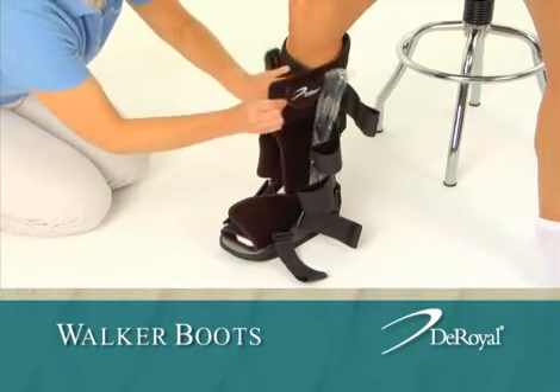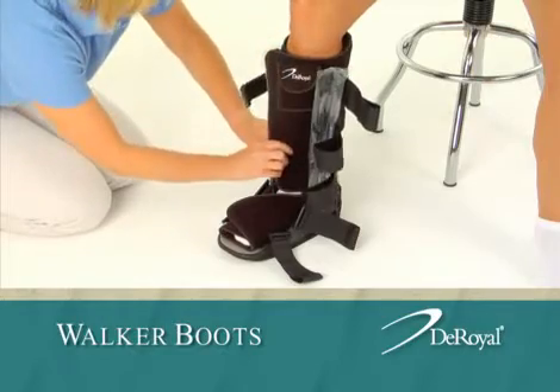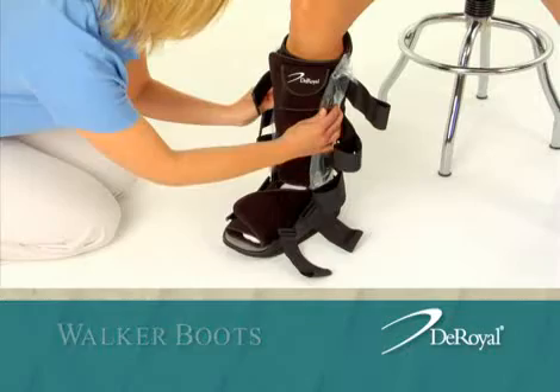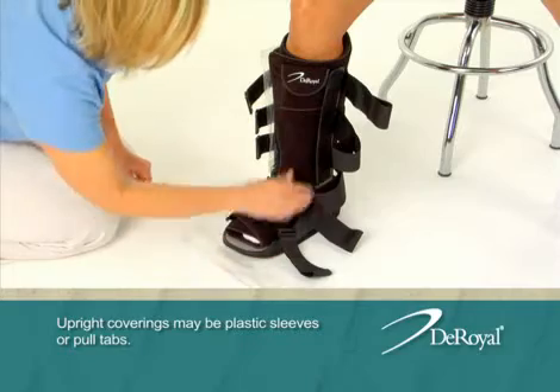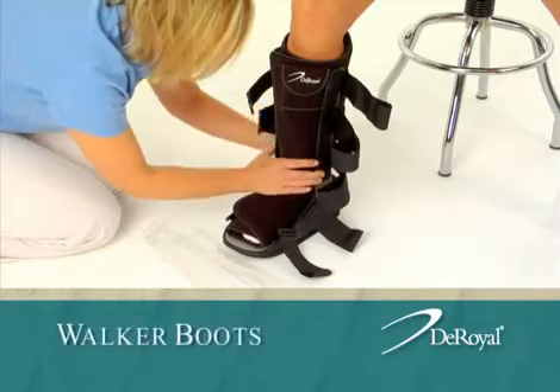Secure the wrap around the foot and leg. Center the uprights over the ankle so they are parallel with the patient's leg. Remove the upright coverings from the hook strips on the inside and secure the wrap to the uprights.